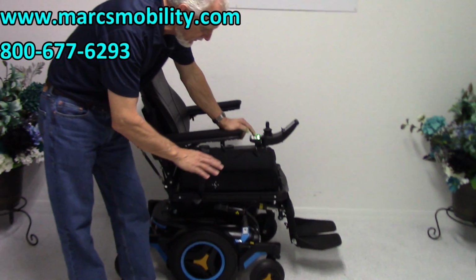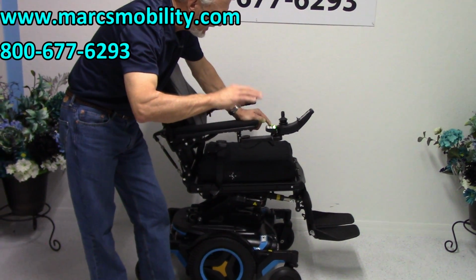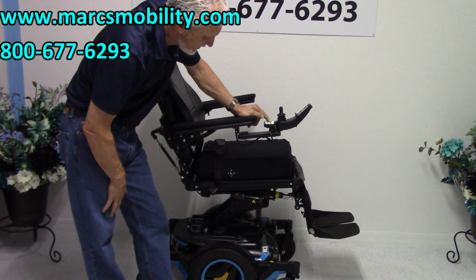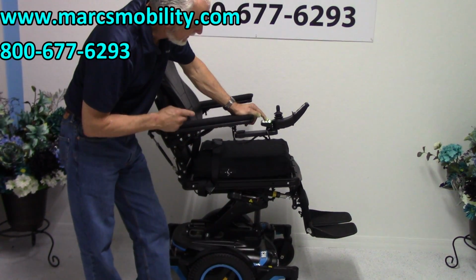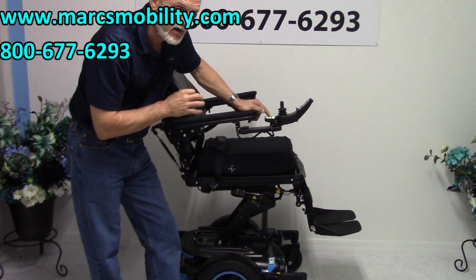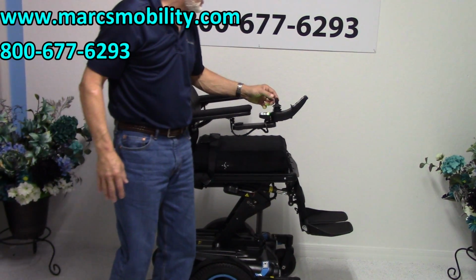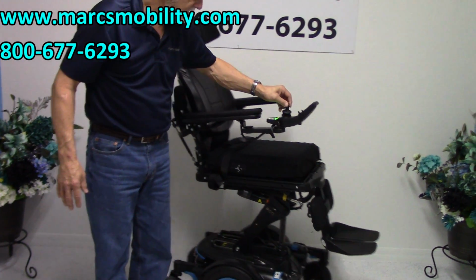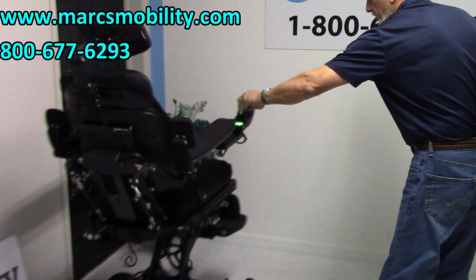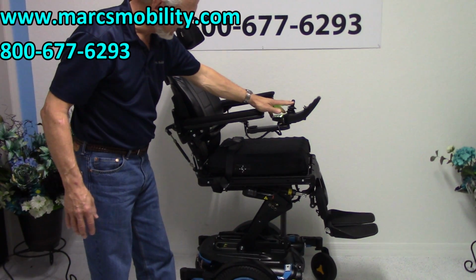the seat will start when it's down at 22 inches, and you got to add 12 inches. By the time it's all the way up, it'll be at 34 inches high. 34 will be the top of the seat. The nice thing about these chairs now, when the seat is elevated, you can still drive these chairs at a reduced speed, but they still drive. So if I was to drive it right now, you can see it still moves at a decent speed. I can't go fast in here because I don't have a lot of room, but you can see how it does move with the seat elevated.